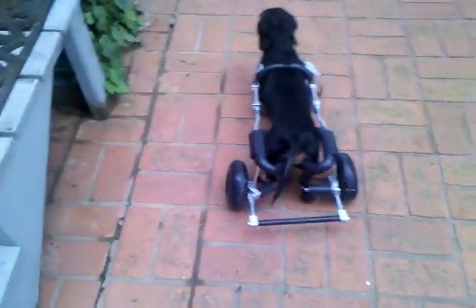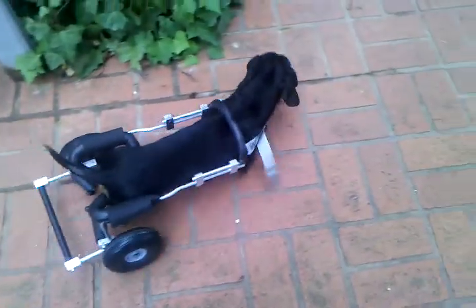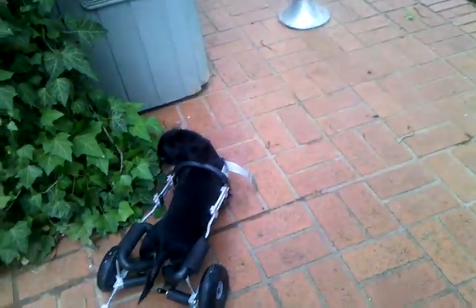That one stirrup is a little loose, I've got to tighten it back up. And that little gray piece — I've got to cut that little gray piece of webbing off there.